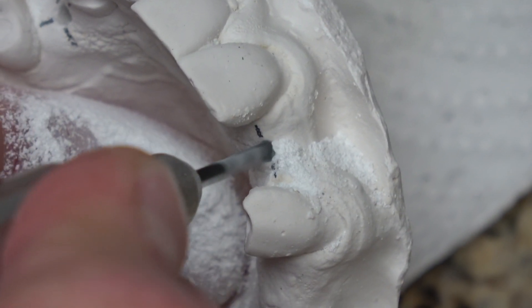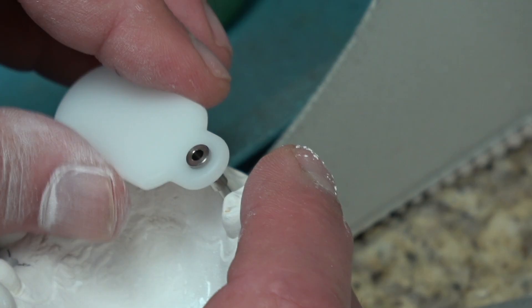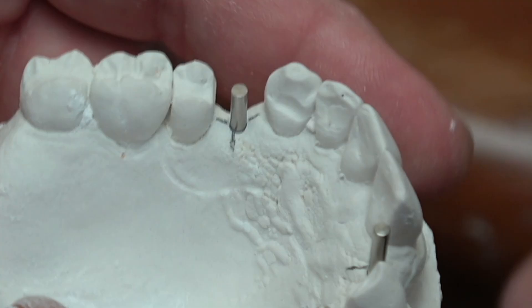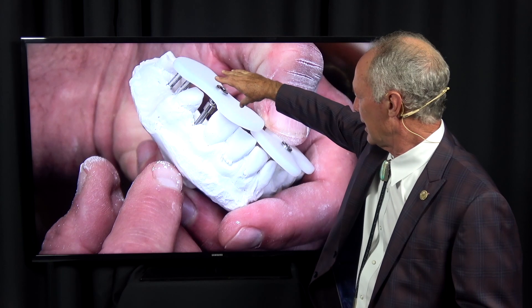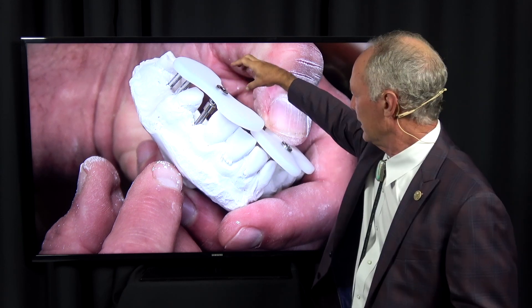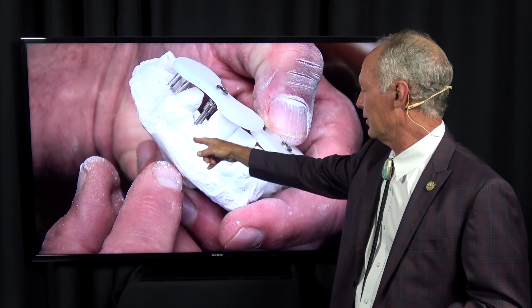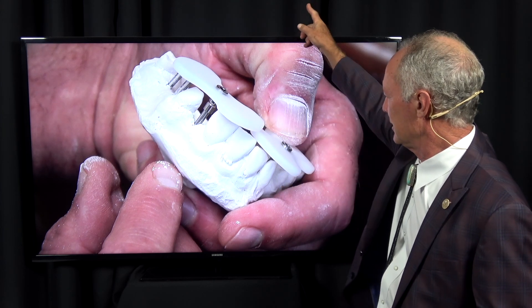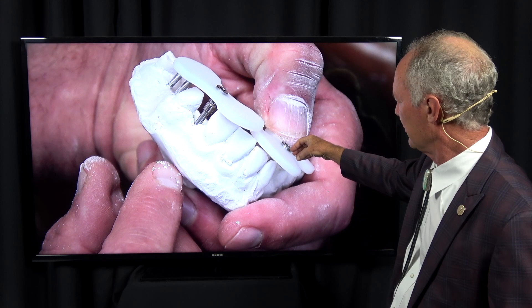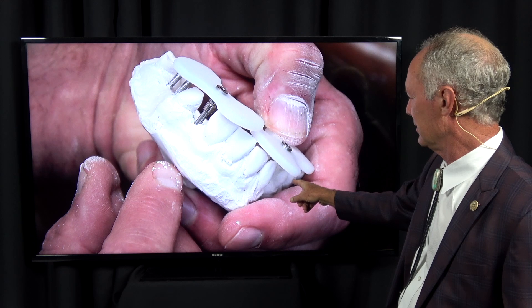We're placing a maxillary right first bicuspid and a maxillary left lateral incisor. The lateral incisor will use this type of Easy Stent — I'll conform it to these teeth and the cuspid. For the right bicuspid, I'll use this other Easy Stent and conform the surgical guide to the cuspid, the lateral incisor, and the second bicuspid.